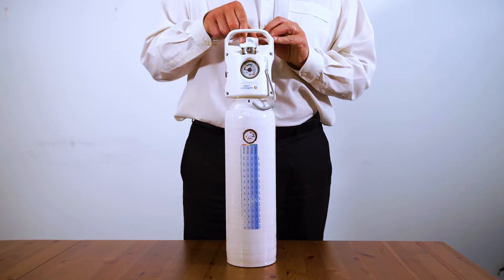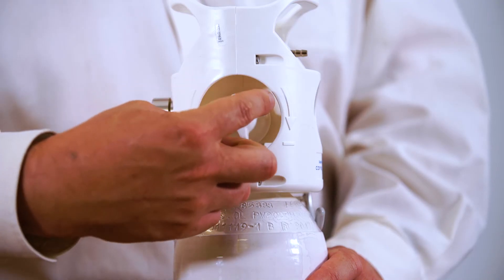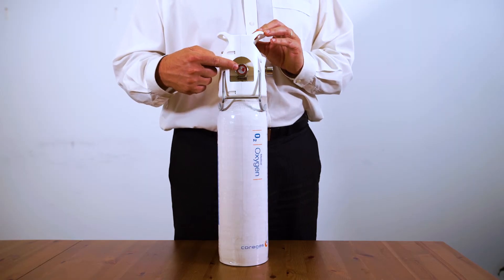When you're finished, turn the flow knob back to zero and turn the open and close valve off in a clockwise direction. This port is for Coregas to fill the cylinders — you don't need to do anything with that.